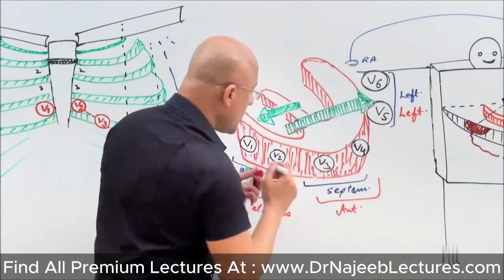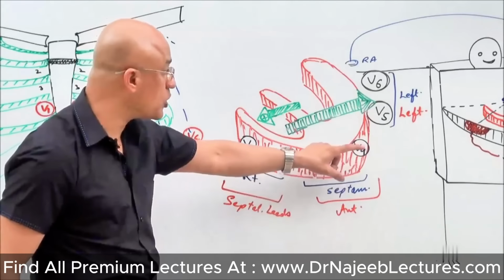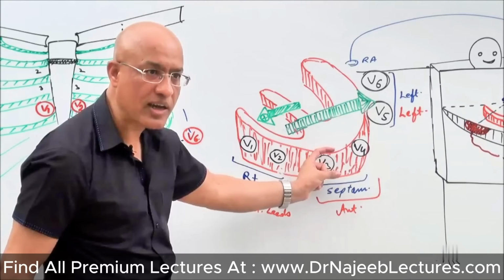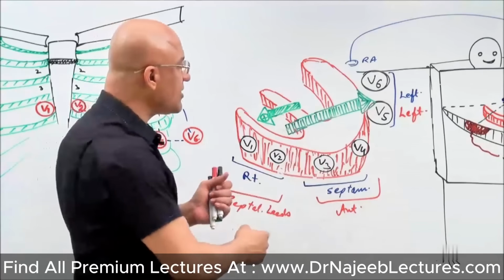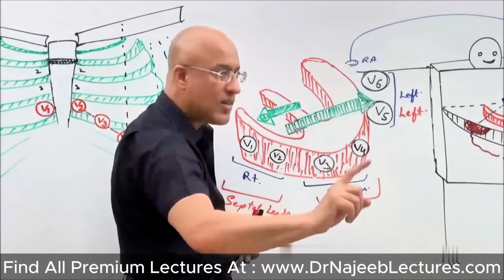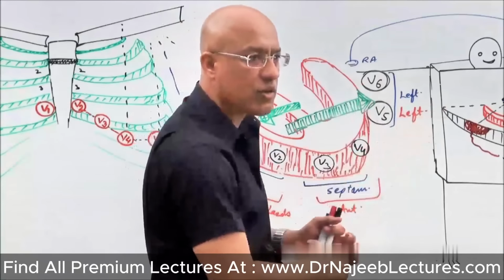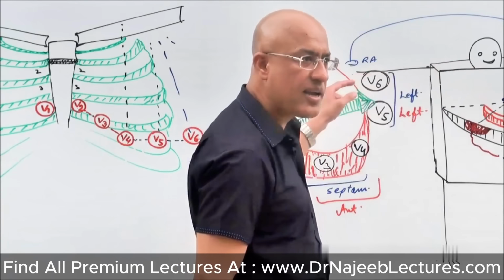Now here, previously we mentioned that anatomically V3 and V4 are oriented over the septum. But functionally, they are most sensitive to very anterior myocardial infarction or ischemic changes. Is that clear? No confusion? And when there is lateral myocardial infarction, which leads will record? Left chest leads, V5 and V6. And of course, left limb leads also, which you already know: bipolar limb lead 1 and AVL.